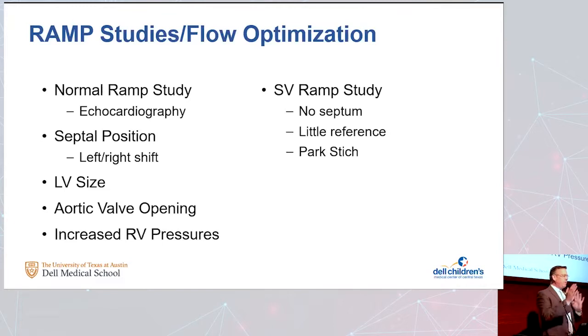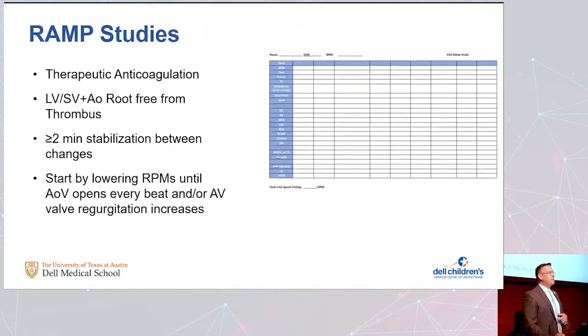There's no septum to look at for septal position. Very little reference on what size ventricles are going to be proper. And you very well may have a Park stitch in place so you can't observe that aortic valve opening properly. So we took these kids to the cath lab.